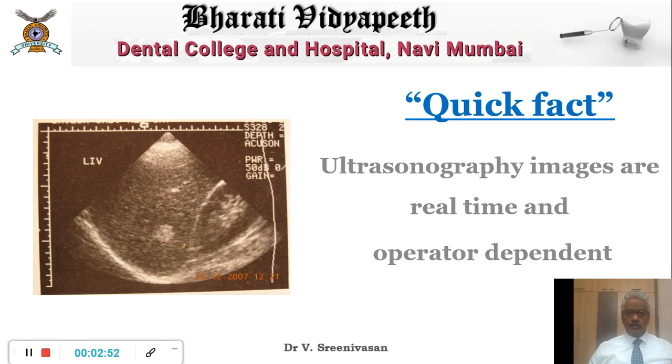Third, ultrasonography images are real time. You are actually doing it and recording it by the operator then and there. Unlike many of the radiographs that even a technician can take, ultrasonography is usually done by the radiologist himself, and it takes a little expertise for him to decide how to use the probe and how to interpret these images as they come up on screen. You also can see, as I shall say in the next radiograph, that it's pretty difficult for you to make out the anatomical basis of these images.